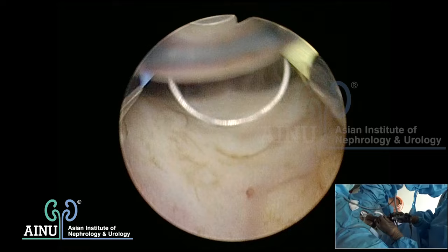I'll look at the tissue pieces and attachments remaining in the prostatic fossa for toileting. Small chips expose the capsular area very well. You can see the capsule clearly - small adenomatous tissue chips being taken out to expose the capsule. This is called toileting of the prostatic fossa. It gives you a smooth surface of the prostatic fossa that looks very nice.